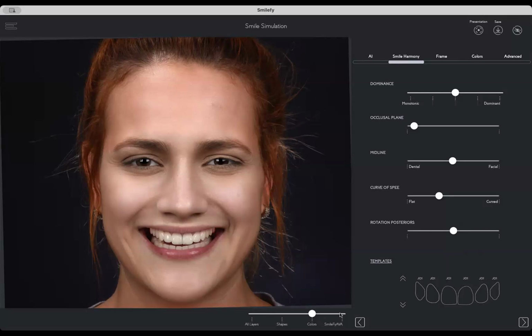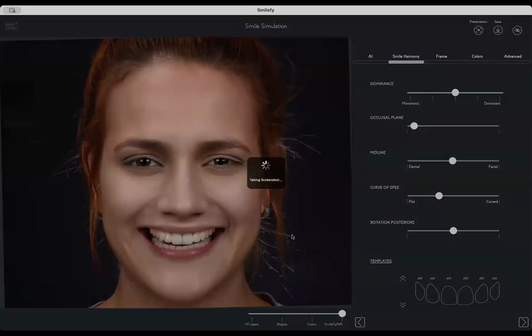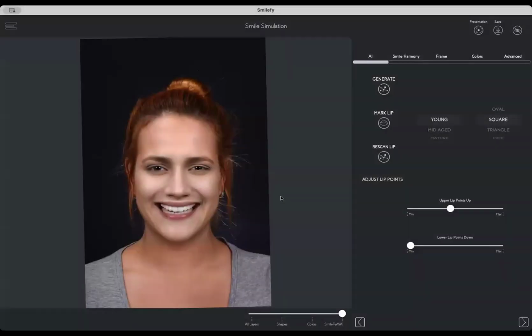But you can say, do you see the advantage of an aesthetic treatment? Which way do we want to go? Dominant smile, closed embrasures, square embrasures, incisal embrasures, and so on. So you have an open discussion with the patient, and then you get some ideas what the patient expects.